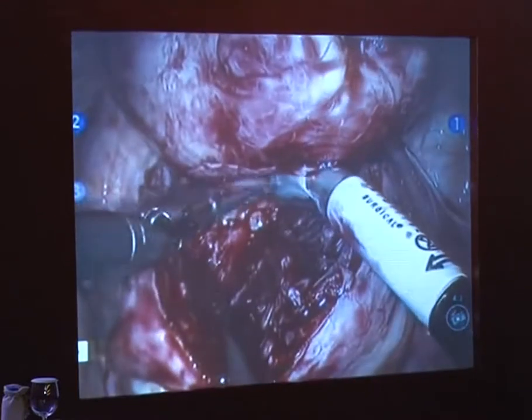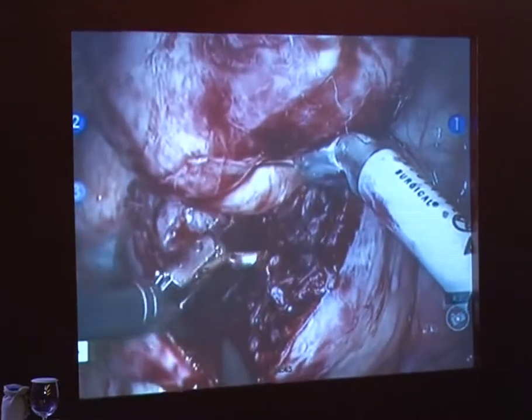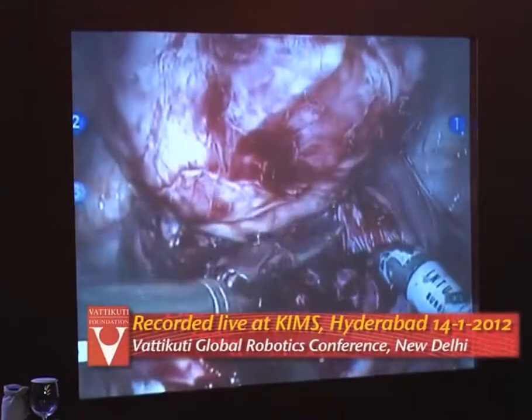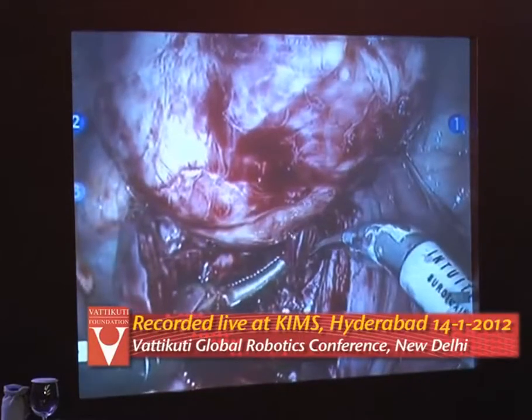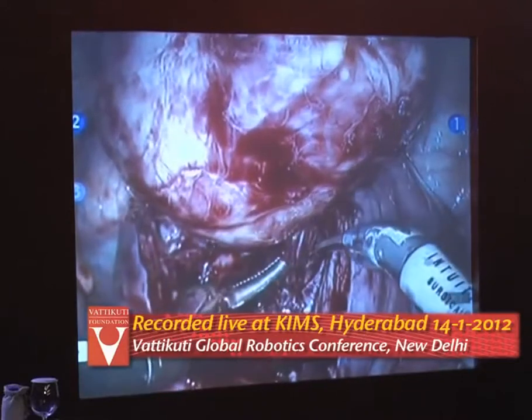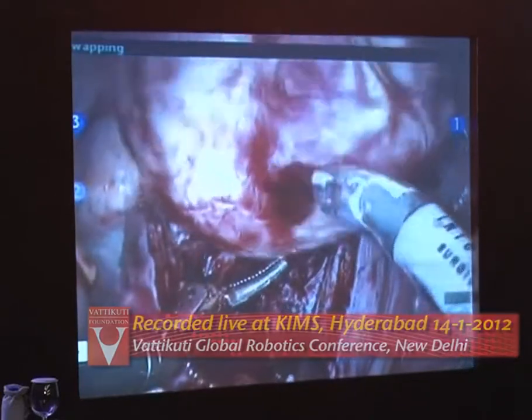In fact, I'm probably better than the open technique, because you know what would have happened by now with the open technique? Somebody would have reached their big hand in there and ripped this fibroid right out, and then it would have been bleeding so much. But instead, we take our time removing it, and then you end up with a much better outcome. So you can see, in not too long a time, we basically got the myoma completely enucleated, and that's a pretty good one. I'd say that's the keeper.